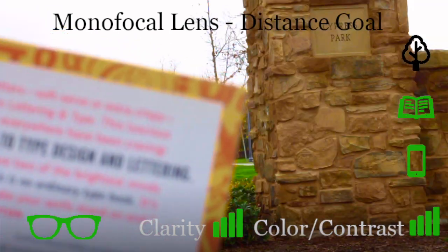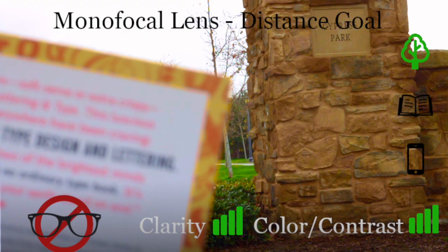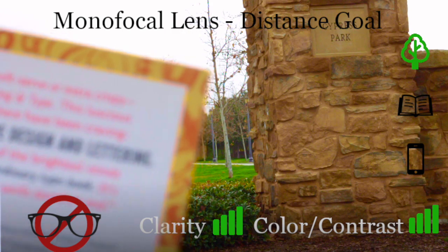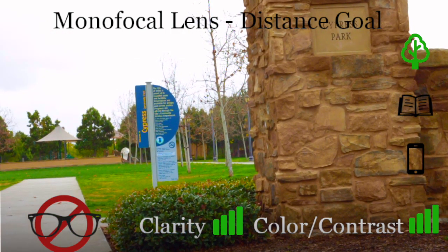So this is a wonderful option for the majority of people. There's no glare and halos at night. And these other lenses that we'll discuss are considered for patients in these specific situations.